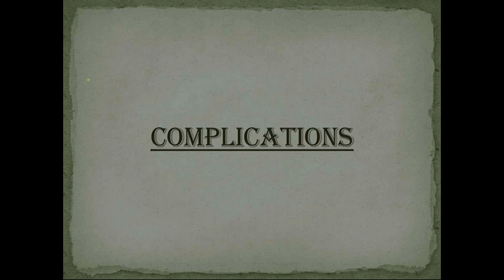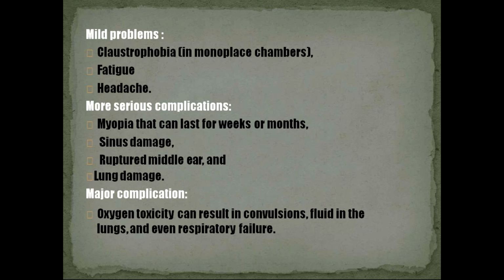Complications. Mild problems like claustrophobia, especially in monoplace chambers, fatigue and headache. More serious complications: myopia that can last for weeks or months, sinus damage, ruptured middle ear due to more pressure, and lung damage. Major complications like oxygen toxicity can result in convulsions, fluid in the lungs, and even respiratory failure.